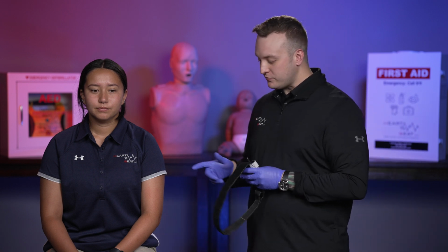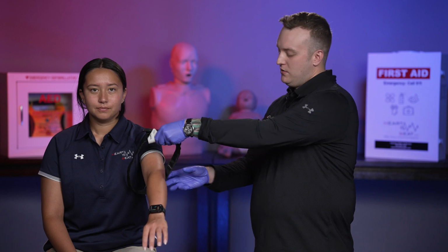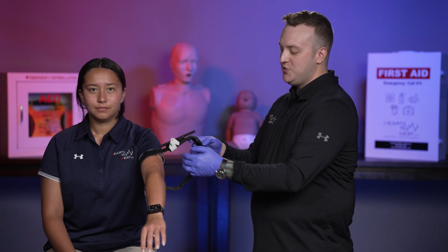When we want to apply a tourniquet, we want to look at the site of injury first. I'm going to use Chloe here as a demonstration. If she has an injury to the lower portion of her arm, we want to look to see there's at least 2 to 3 inches above that injury where a spot for a tourniquet is available. If there is, we're going to slide the tourniquet on loose above the injury, at least 2 to 3 inches.